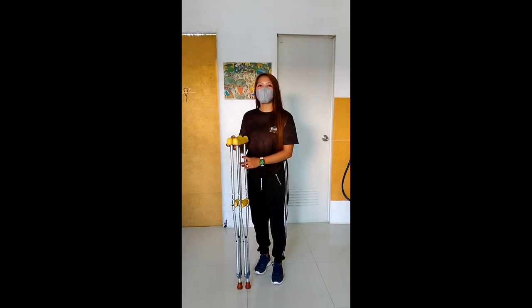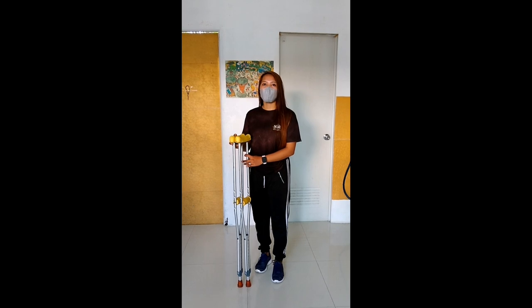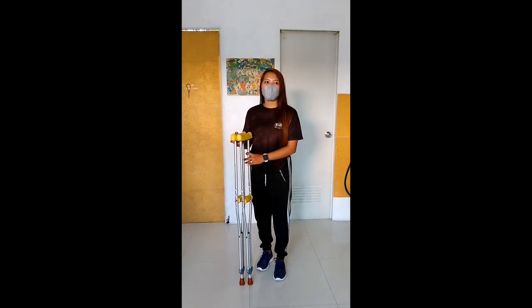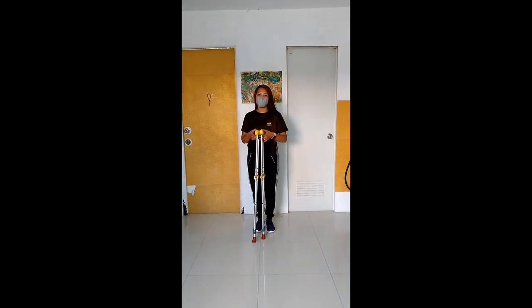Meron po tayong different ways of crutches. Ito po yung 2-point, 3-point, 4-point, swing-to, swing-through, and ascending and descending. Ngayon po ay gagawin ko na po yung 2-point gait.